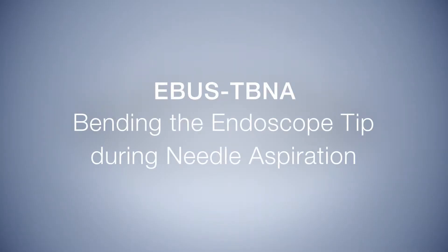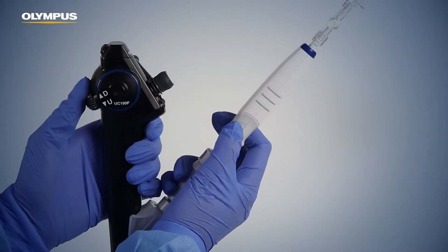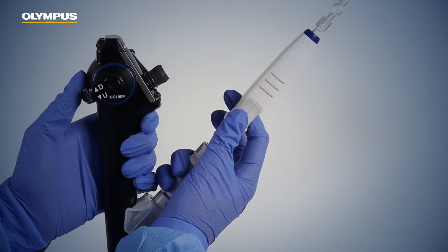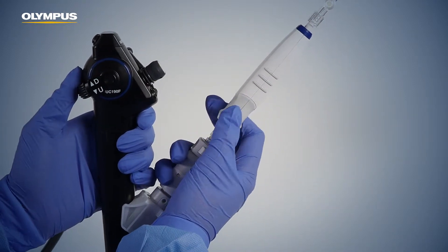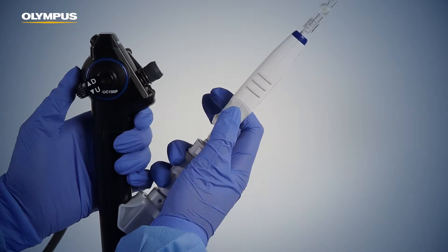Bending the endoscope tip during needle aspiration. When inside a lesion, it is also possible to reach other areas inside it simply by using more or less pressure on the angulation lever of the endoscope handle.